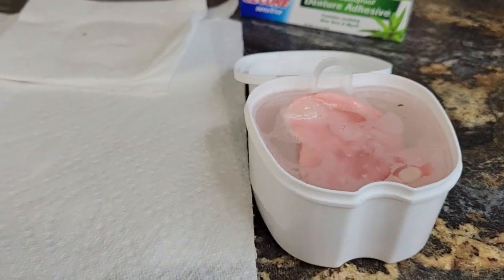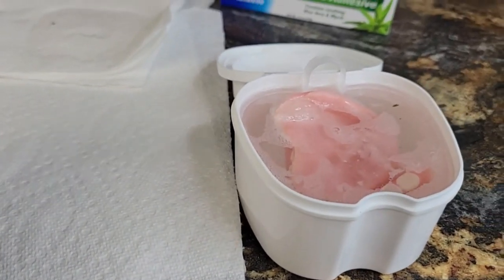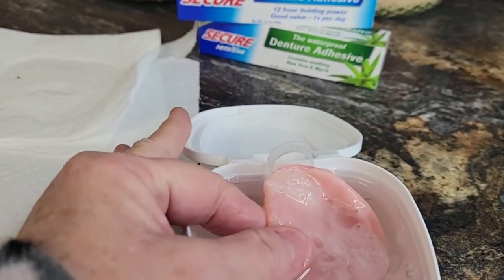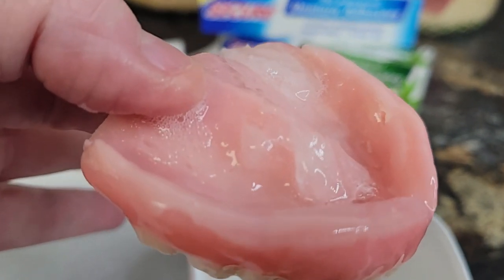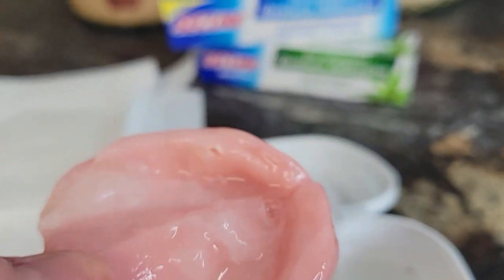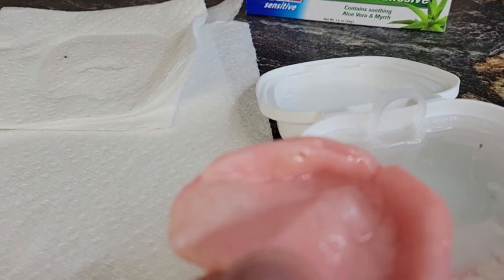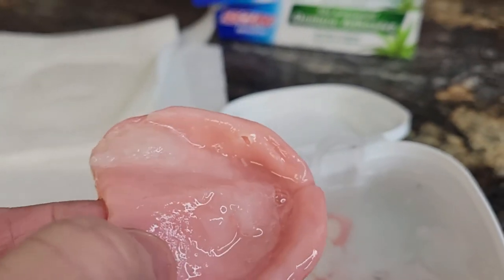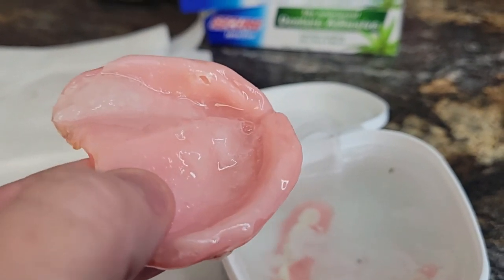All right, let's take these out of here and see what they look like. Now, they might be gross, but you know what, hey. Okay. Do you see how the gel kind of blew up there? That's because it acts like a sponge and it collects water.